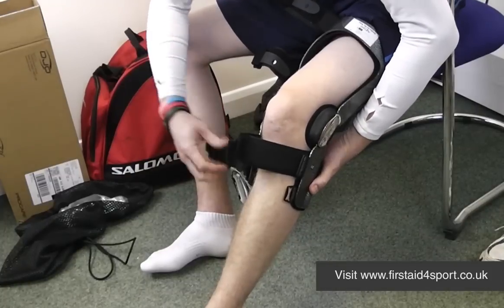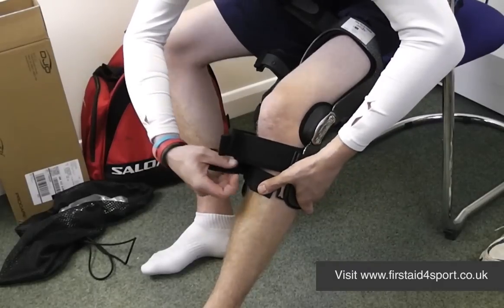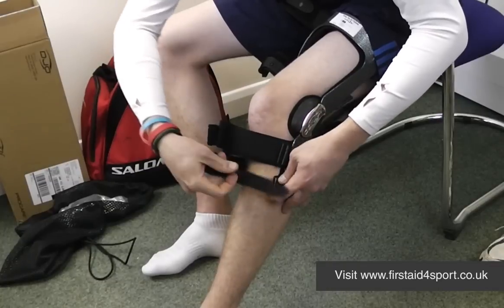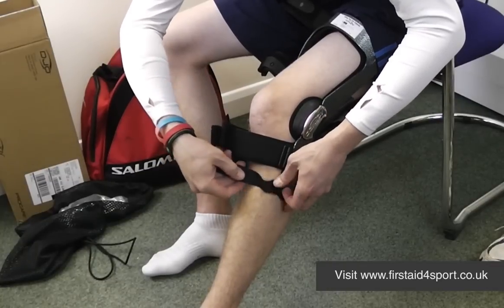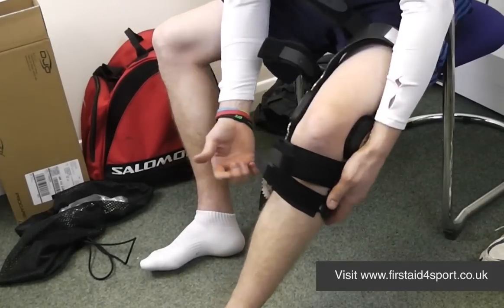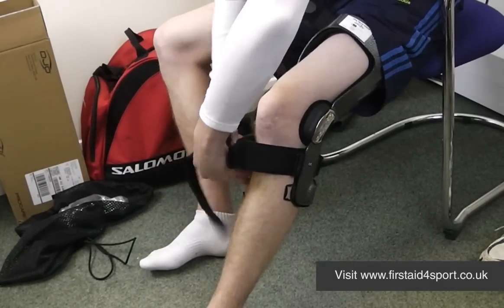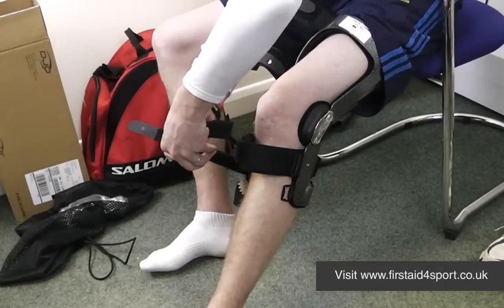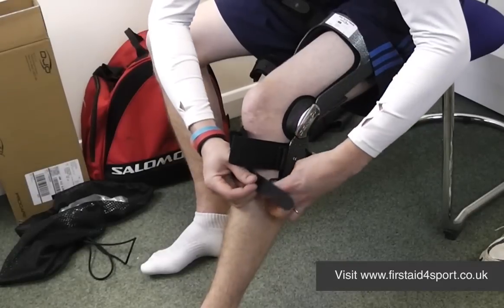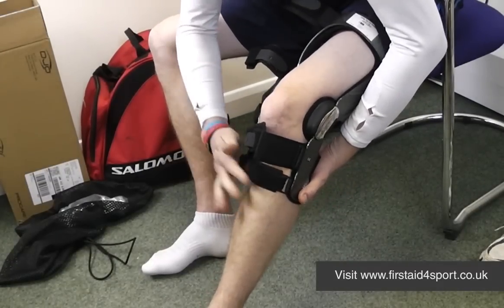Start with number one at the bottom. To get it right and comfortable the first time, you can take off the pads and feed the strap through. They need to be tight enough to hold the brace up. If the strap is too long, you simply undo it at the back of the brace — it's all adjustable, so you pull it a bit longer, redo the padding, and try again. That's number one.